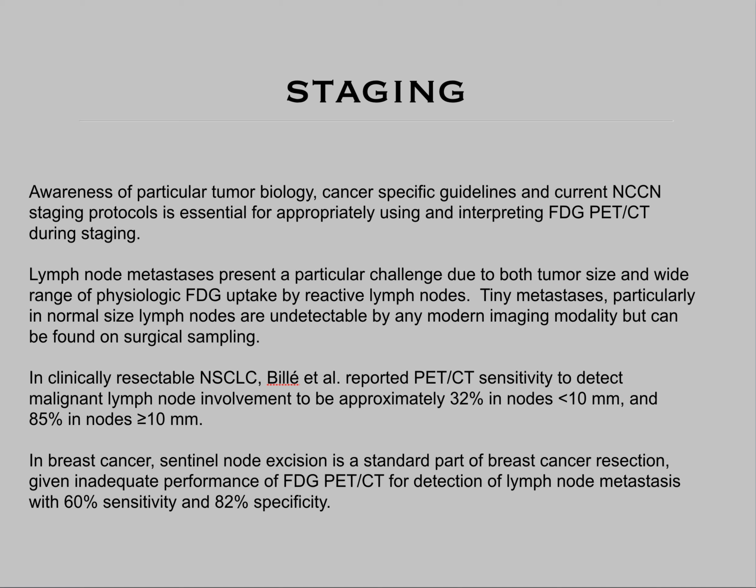However, PET-CT will never be as good as pathology, which is why in circumstances like breast cancer, when we can easily sample the lymph nodes, the patients do get sent on a lymph node dissection. In the lung cancer, this is more complicated depending on the center involved. The patients should generally receive mediastinoscopy and EBUS if available to look at the lymph nodes pathologically prior to resection.